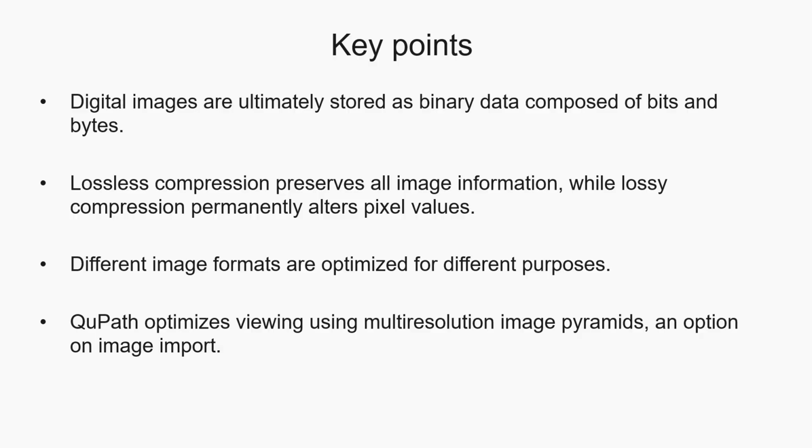To conclude, remember that digital images and microscopy datasets can be extremely large, and so compression plays an important role in reducing storage requirements. However, it is critical to understand the difference between lossless compression, which preserves data, and lossy compression, which permanently alters the image. Different image formats serve different purposes. Formats such as JPEG are useful for sharing and presentation, whereas TIFF-based formats are generally preferred for scientific image analysis. OME-TIFF has become a widely adopted standard for storing microscopy images, along with their associated metadata, while OME-Zarr is helping address the challenges of cloud-scale bioimaging.